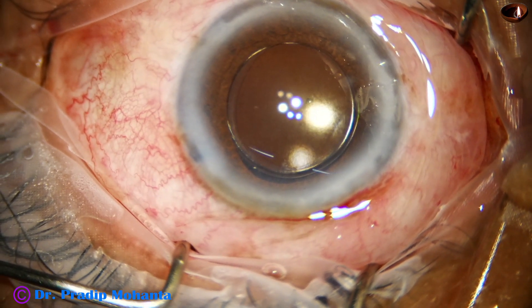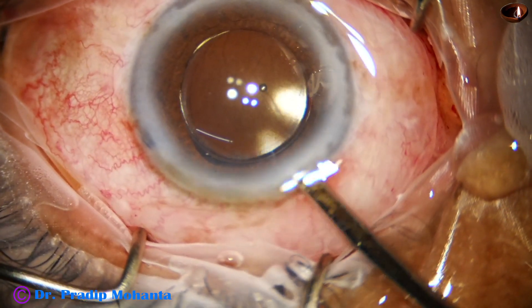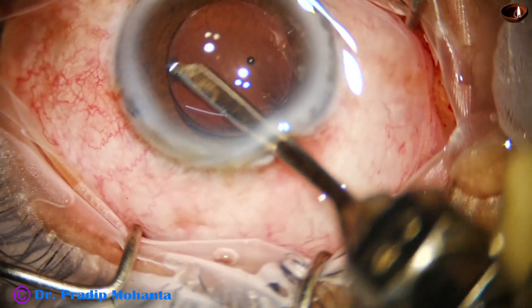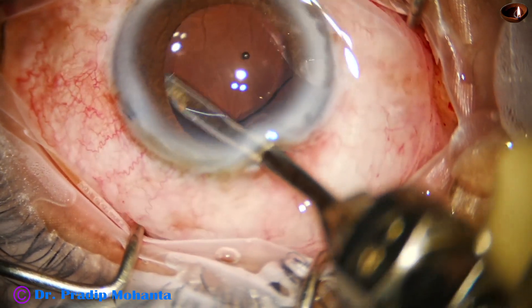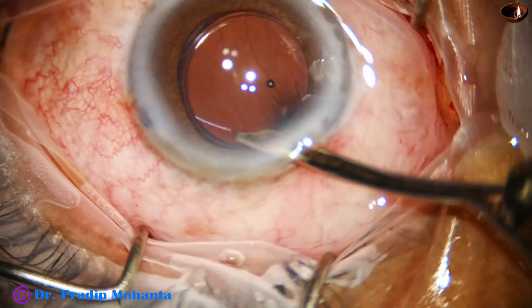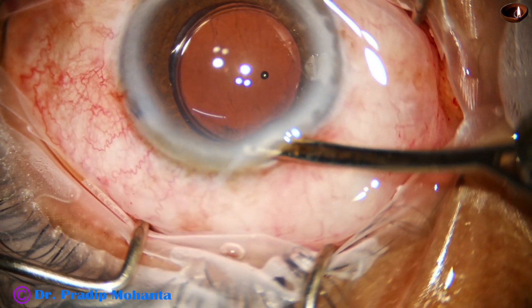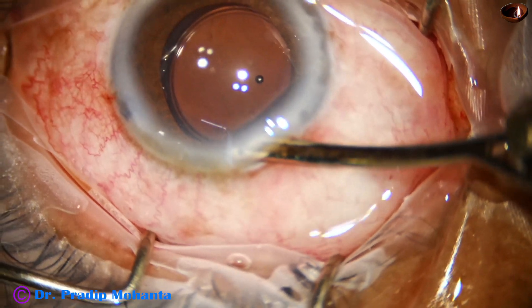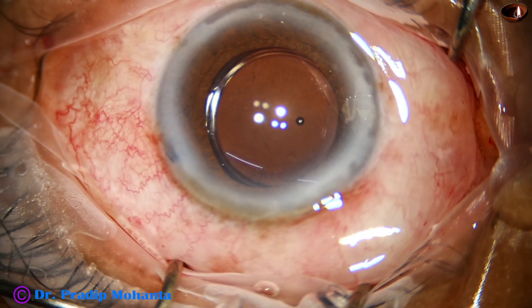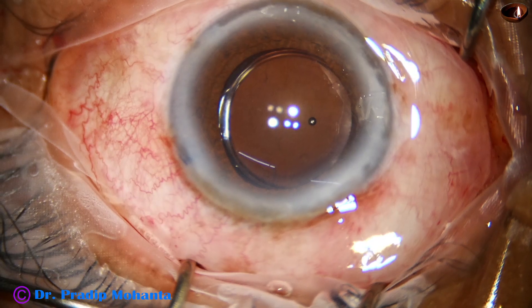The side port is closed, followed by the final lavage of the anterior chamber. Any remaining cortical fibers are not expected to cause a problem. The anterior chamber and eyeball are formed, and the intraocular pressure is checked digitally to conclude the case.